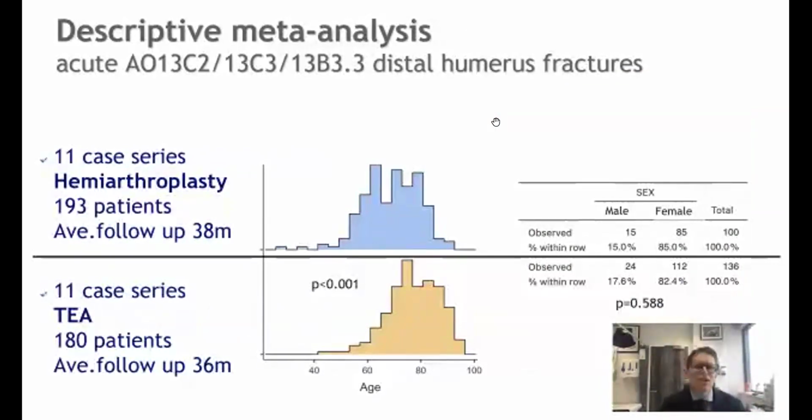If we look at who is currently getting elbow replacements, this is from a systematic review of the published literature, we can see that the demographics are very similar between total elbow replacement and hemiarthroplasty, but with a longer tail to the younger age group, suggesting that maybe with the hemiarthroplasty we're less likely to try to fix and reach for the arthroplasty option as a bailout.